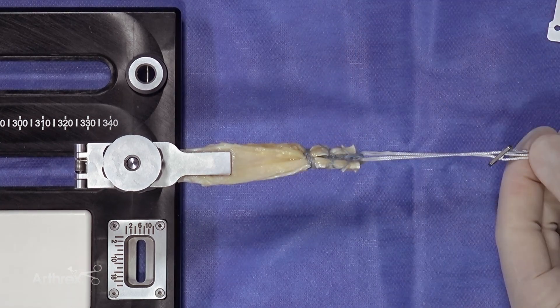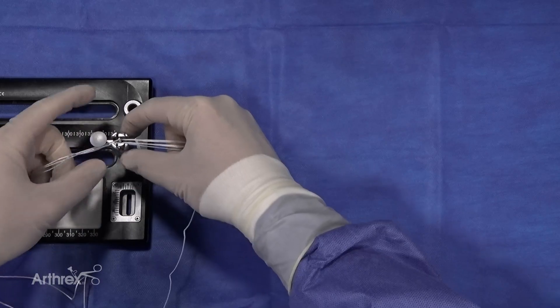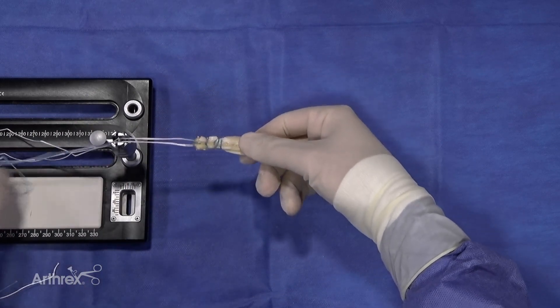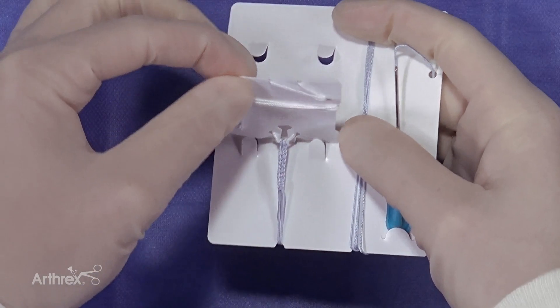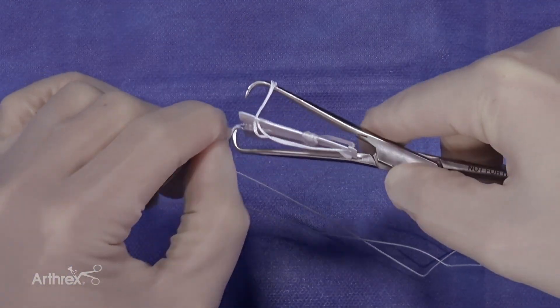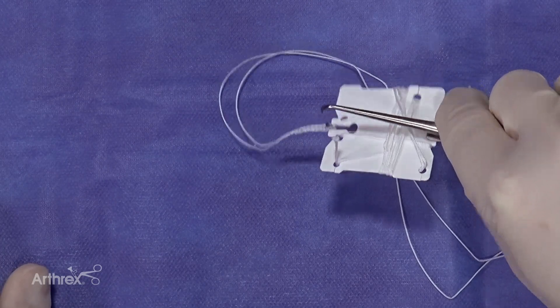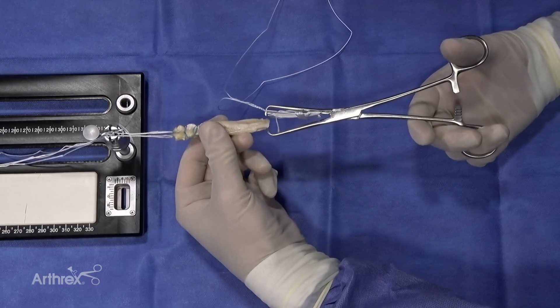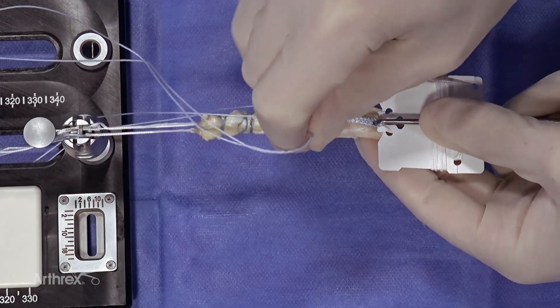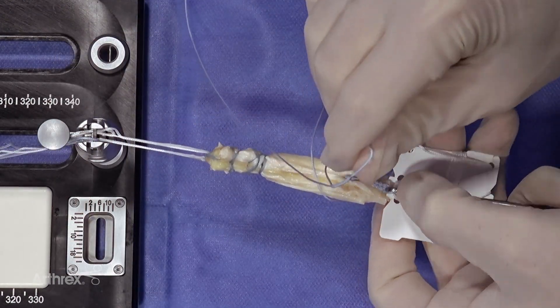We then place it in the button holder. This eliminates the need to have another set of hands. This is the fiber tag ABS tightrope. We use this on the tibial side. It comes without the button which we add later for tibial fixation. Again, it works exactly the same way. We lock the cord in, pierce the fiber tag, and we're ready to place it on the end of the quad graft. The fiber tag portion of the implant is between 18 and 20 millimeters in length.